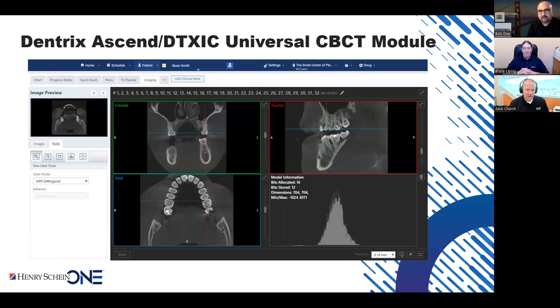Not everybody does that. Correct. There are a lot of imaging products out there that just don't bother with pursuing FDA certification. And our imaging product has passed and will continue to pass FDA regulations that say this is an approved imaging diagnostic tool. Just wanted to touch on that.